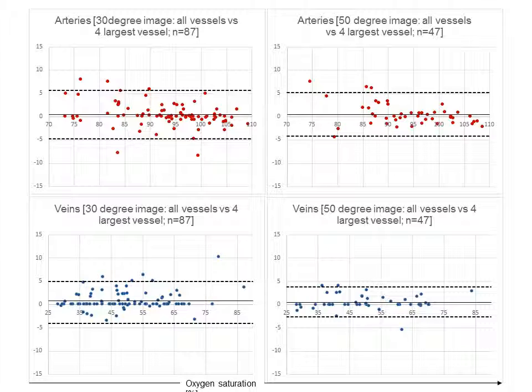Because I think the biggest problem is still that we need to standardize things more if we want this to be a clinical tool, easy to apply, easy to analyze, and also to create software that is easy to use and more accessible for the clinician, so that we get to a point where we feed in the image and click a button and it pops out with the values, rather than having to do a lot of interaction with the software.